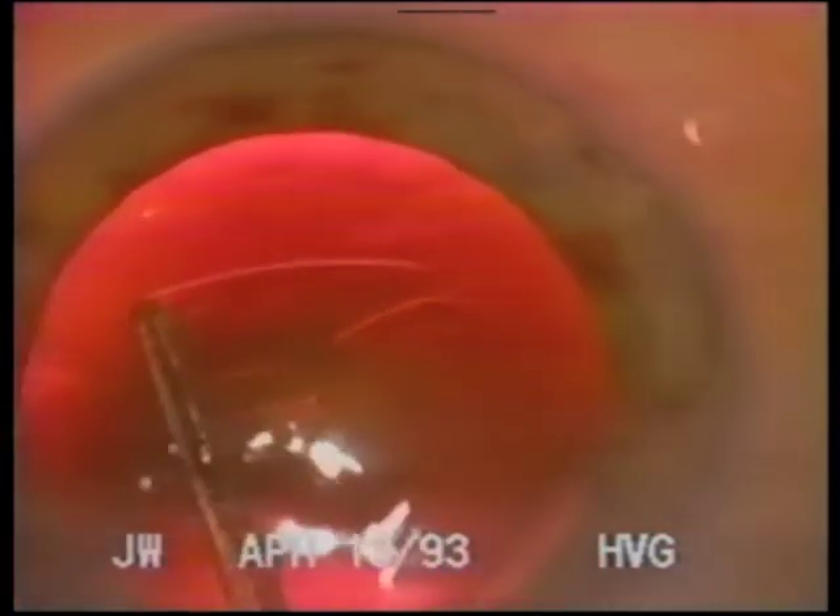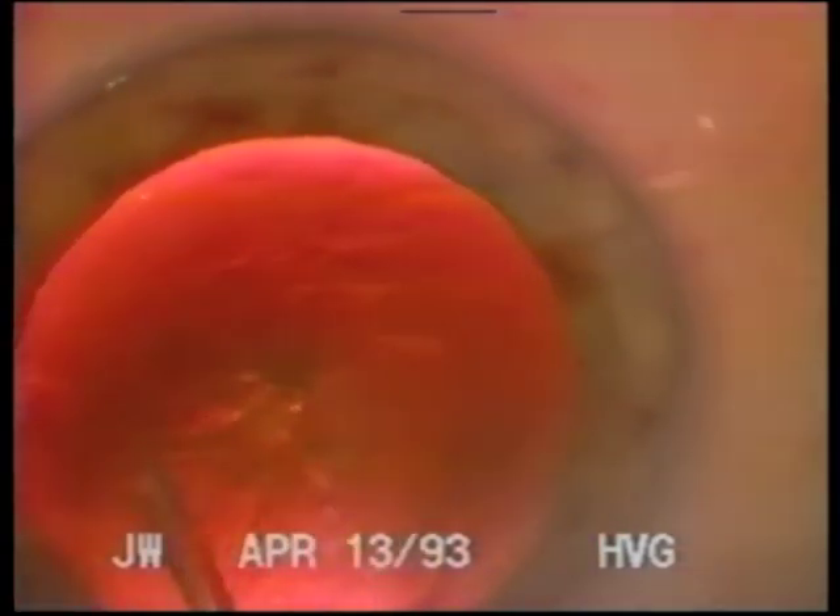Due to Helon's high pseudoplasticity, it does not impede the passage of the capsule forceps. As well, it acts as a soft surgical instrument that holds the capsule flap where it is placed. I make the diameter of the capsulorhexis either smaller than the optic of the implant to be used, or larger, so that the edge of the capsule is not partially over and partially under the edge of the optic.